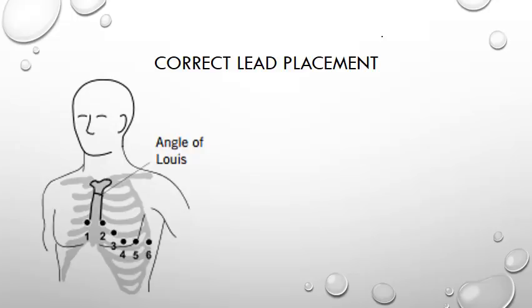Use the same technique for finding the fifth intercostal space and place your electrodes for leads V4, V5 and V6 along this line laterally in a mid-clavicular, left anterior axillary, and left mid-axillary line. Lead V3 is then sited between V2 and V4. You are now ready to get a good quality ECG to be printed out for you to interpret.